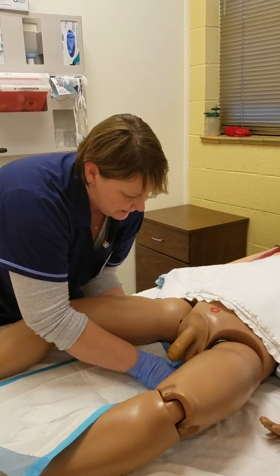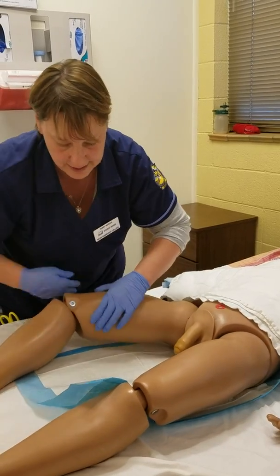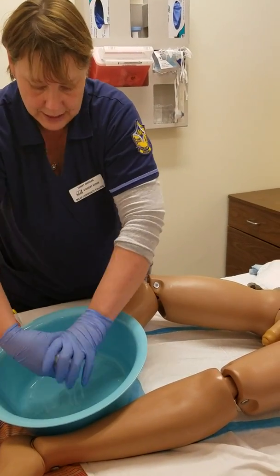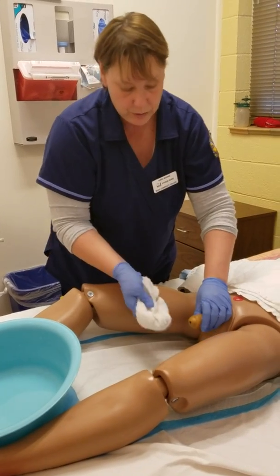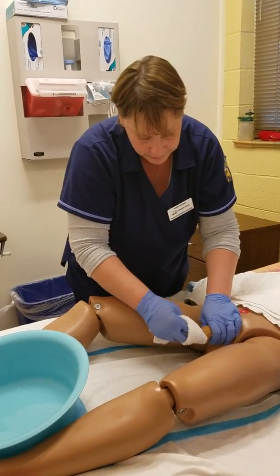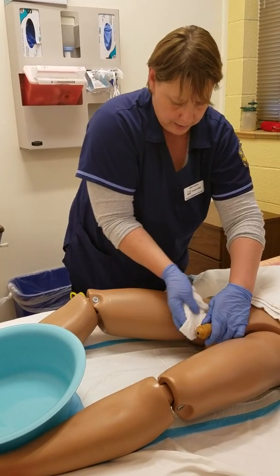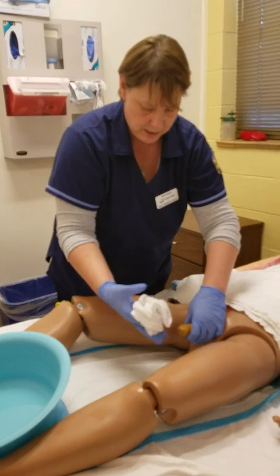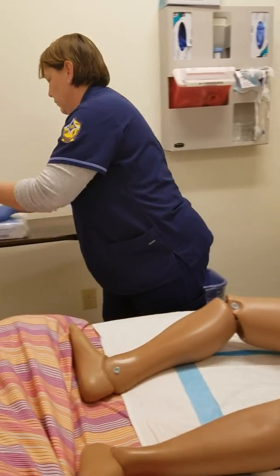Jose, can you just lift your bottom up for me? He seems to be able to do so on his own, but if he wasn't I would ask for assistance. Once I have that all set up, I'm going to clean him with warm soapy water. Jose, you're going to feel me touching you here just for a moment. If he is an uncircumcised male, I'm going to retract the foreskin and clean right around the urethra, down the sides, on top, and along the bottom — getting really well cleaned up.